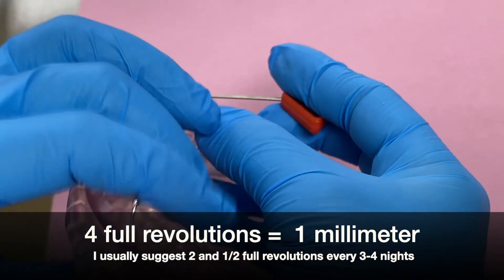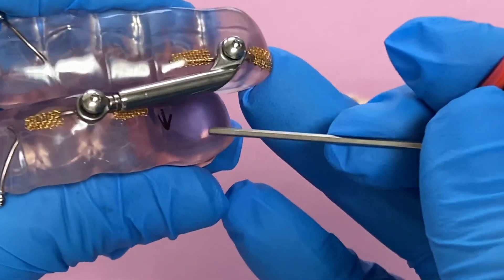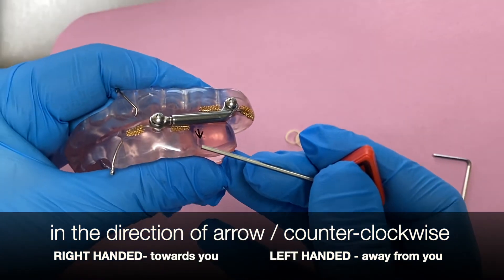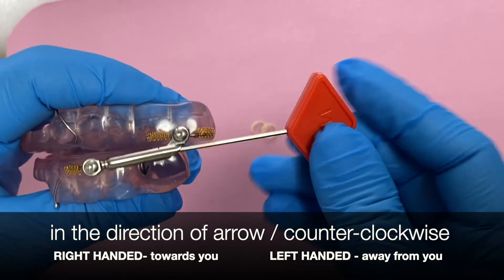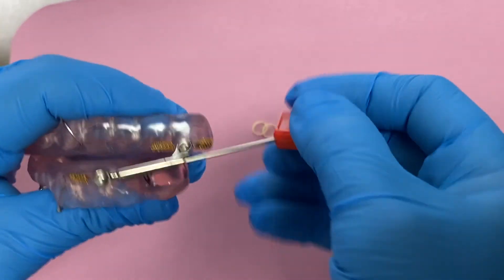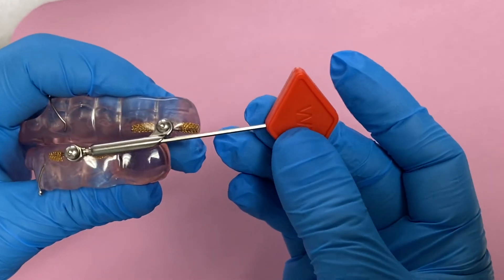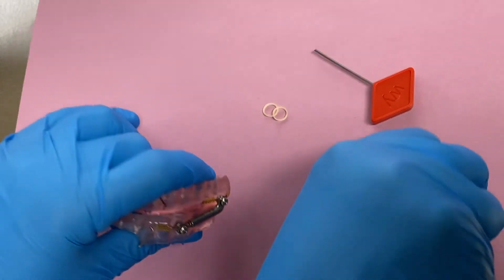You can then flip it around to the other side, get oriented again, look for the arrow if present. Some devices might not have an arrow. Insert the tool into the back of the tube until it falls into place, and once you feel it's in there well you can start turning it two and a half full revolutions — and then another half — then remove it. Those lines make it much easier to tell when you've gone all the way around.